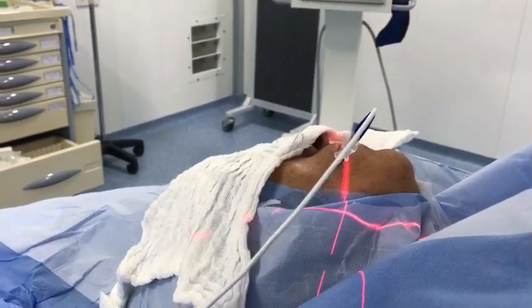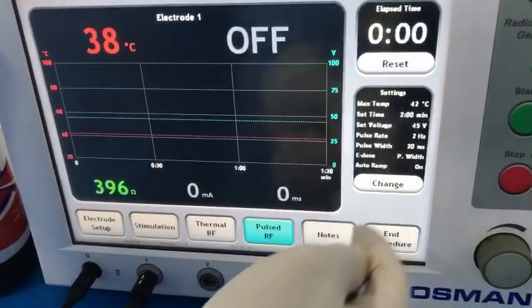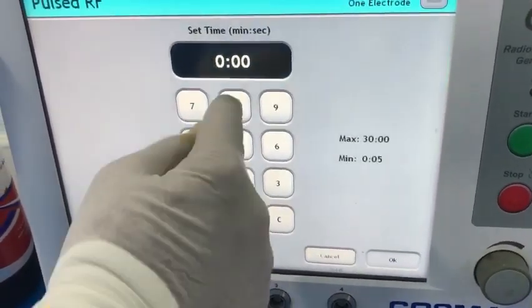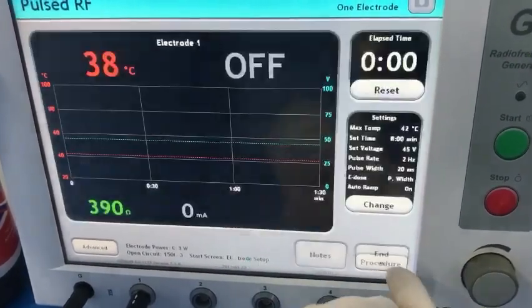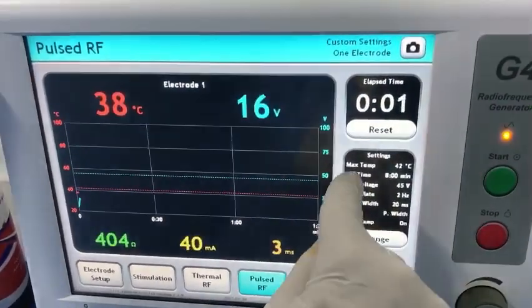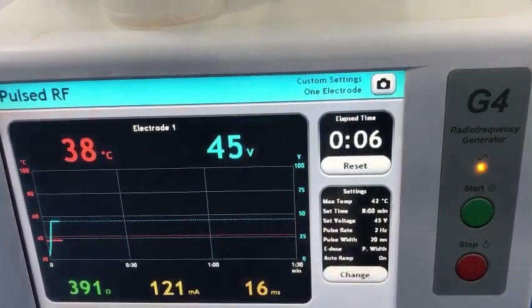Now I will start the pulsed RF frequency. I will set the time here to eight minutes, maximal temperature 42 degrees, set voltage 45. Pulse rate — this is 45 volts.